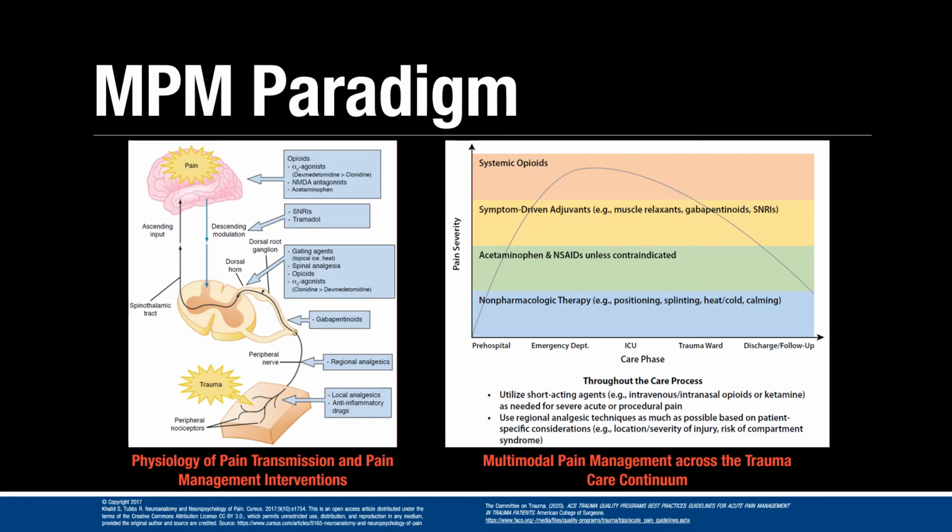So firstly, ultrasound-guided nerve blocks and regional anesthesia techniques are a key component of a multimodal pain management strategy. You may say, well, Townsend, IV opioids are easier and they work just fine. And they require less time, and I don't need as much training to administer these. Why are you talking to me about these nerve blocks? In reality, we should be addressing acute pain in the ED with a multimodal pain management strategy.